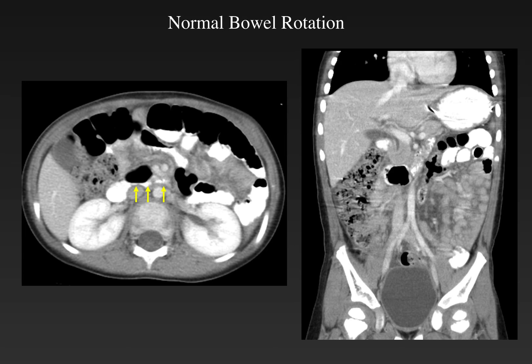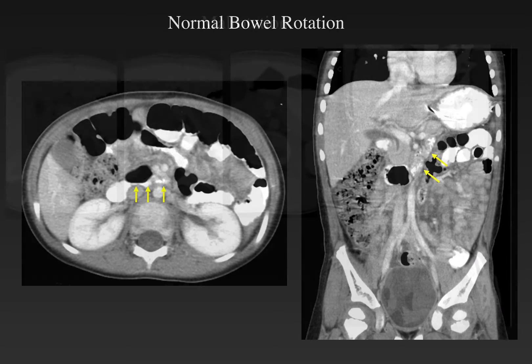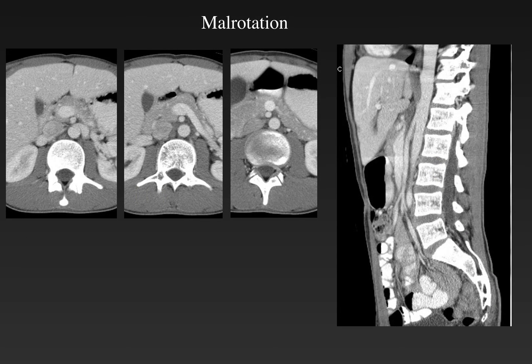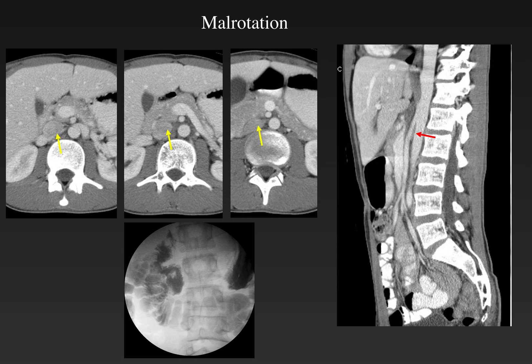Now let's talk about the CT diagnosis of malrotation. In normal patients, the duodenum crosses the midline between the aorta and the superior mesenteric artery and rises to the left upper quadrant to the duodenal-jejunal junction. In patients with malrotation, the duodenum does not cross the midline. Here, a fluid-filled duodenum is to the right of the abdomen and approaches but never crosses the midline. There is no duodenum seen between the aorta and superior mesenteric artery on the sagittal reconstruction. An upper GI series confirms the right-sided small bowel and malrotation.